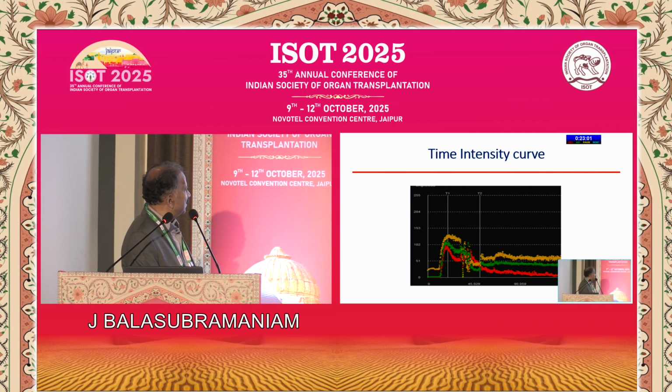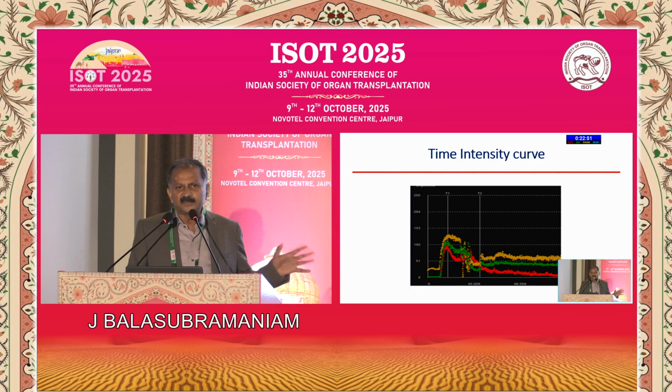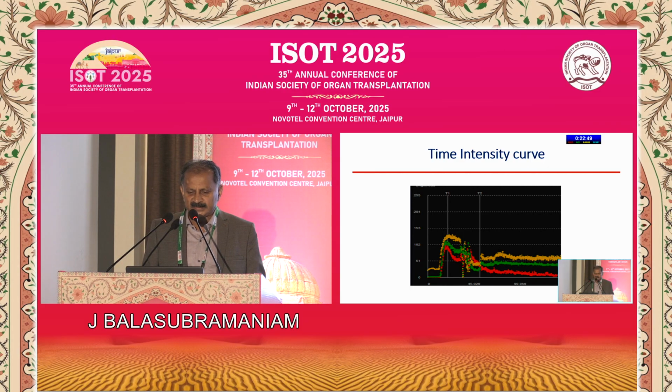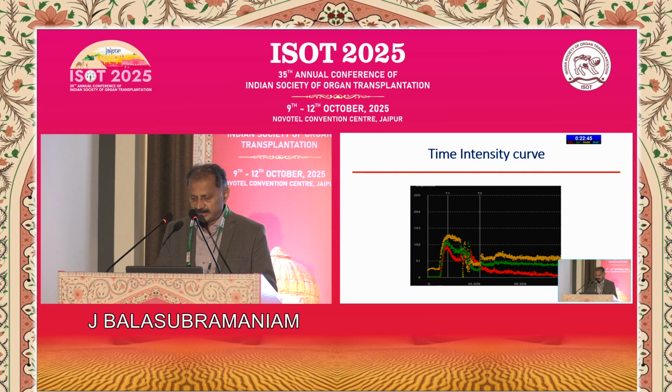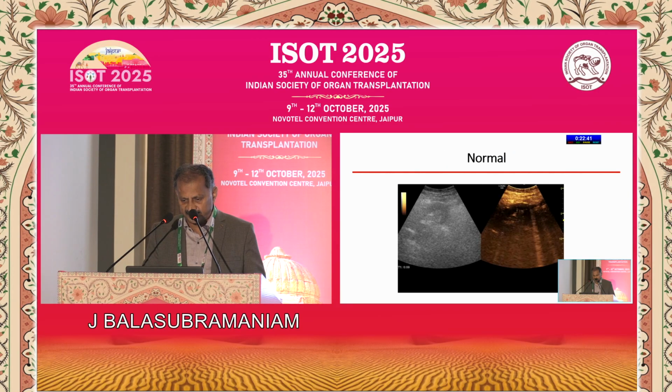Yeah. So this is the time to peak, and this is the washout time, and this is how slowly or quickly it decays. So I've been watching many of these cases and trying to differentiate the values of this and get some formulas, and I am not fully satisfied with what I got so far, but I simply believe that much can be done in this.